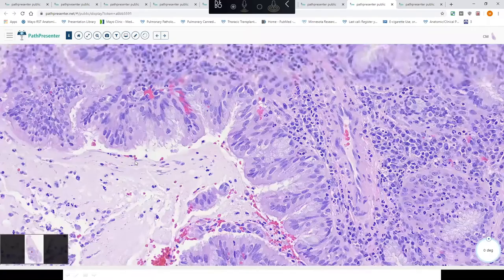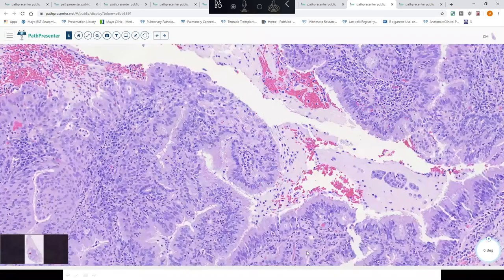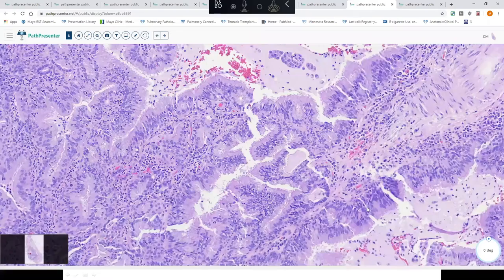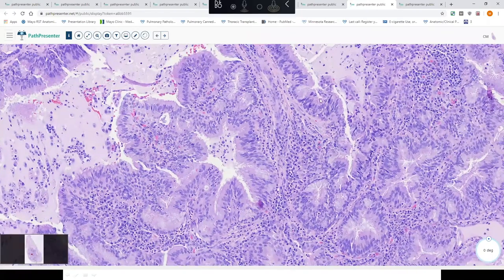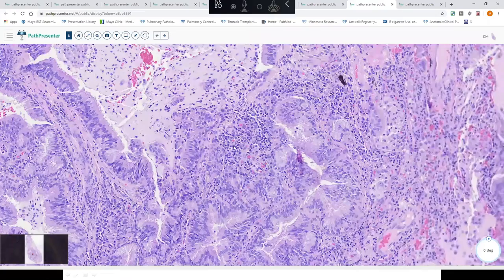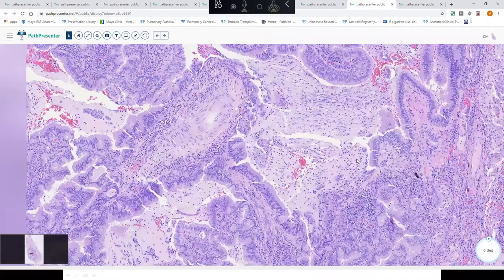I do love it when the name accurately describes the tumor. And then they have these mucinous cells as well. The other name for these is bronchiolar adenoma. There's a paper that expands the spectrum of them. Not all of them will have this kind of characteristic look, so that expands it just beyond this. This is a classic case of a ciliated muconodular papillary tumor.